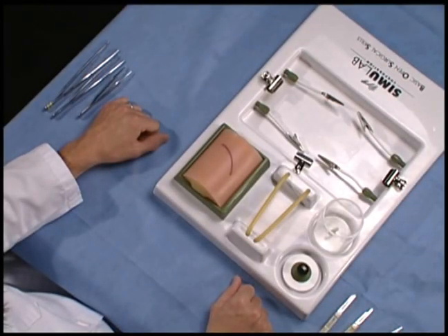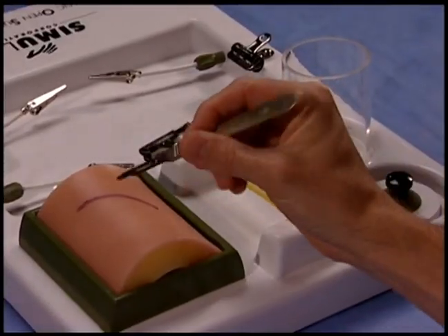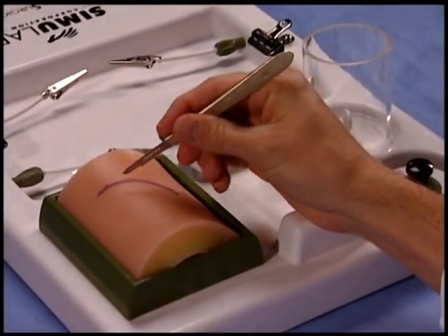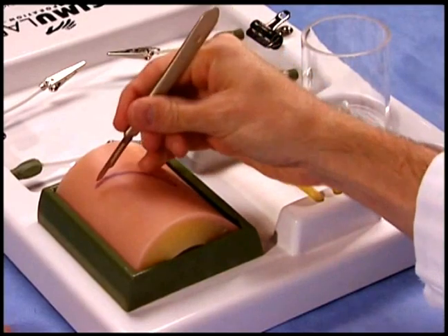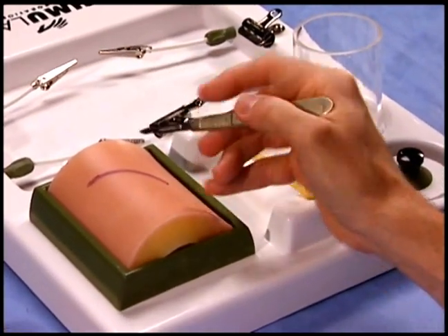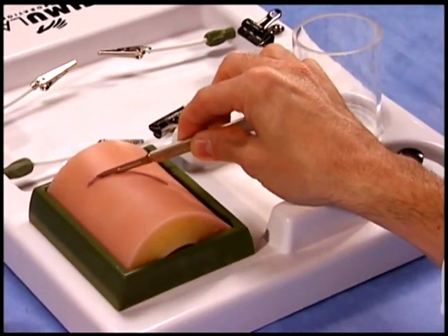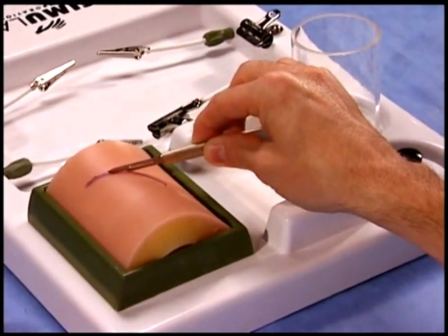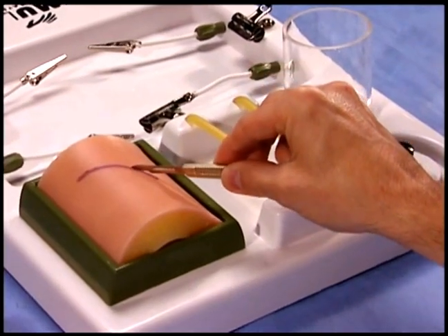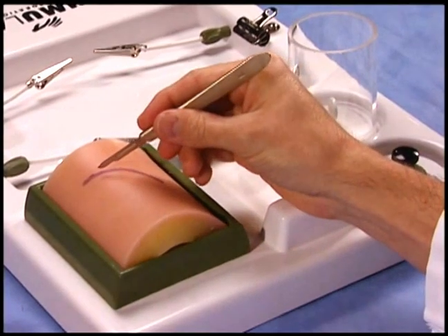A 15 blade is excellent for curved or short incisions. The 15 blade is held like a pencil — this allows the curve of the blade to come in contact with the skin. Flattening your hand like a violin bow precludes adequate use of the blade. Again, hold the 15 blade like a pencil.